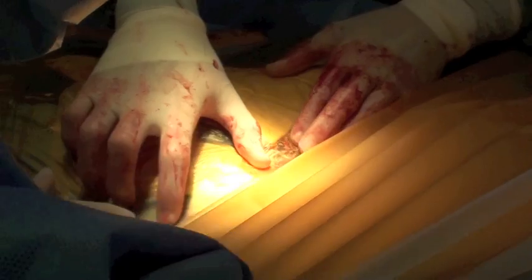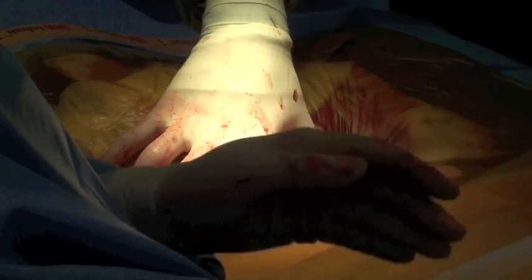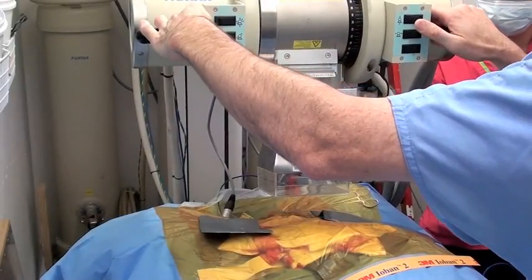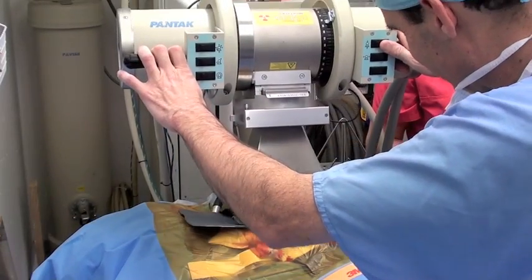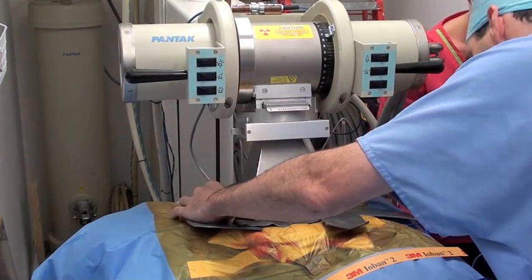A sterile plastic sheet is placed over the entire surgical field in order to allow application of radiation therapy without contaminating the wound. A radiation therapy treatment cone is positioned over the tumor bed, with additional sheeting of lead used to further protect the soft tissues.